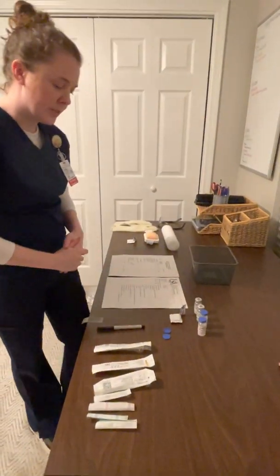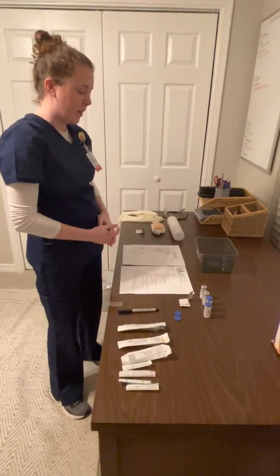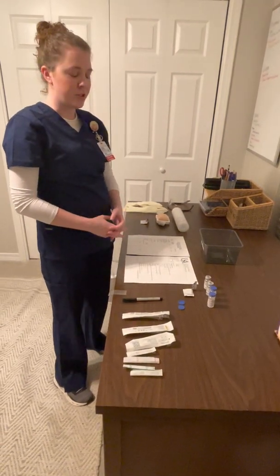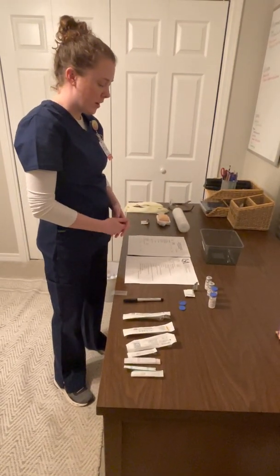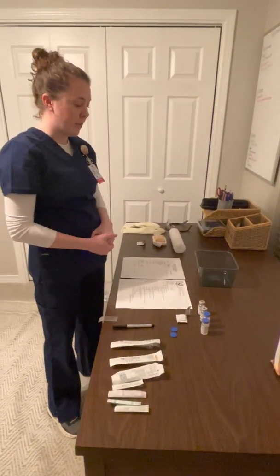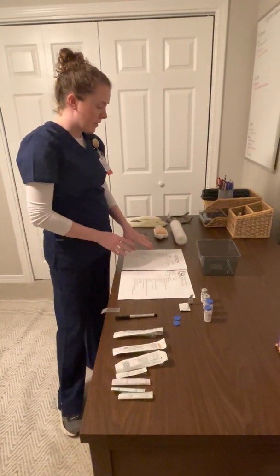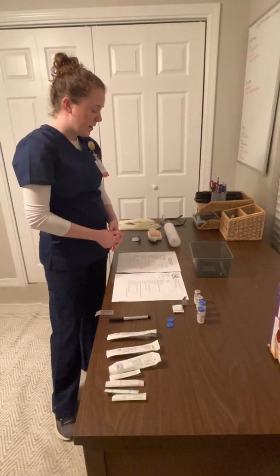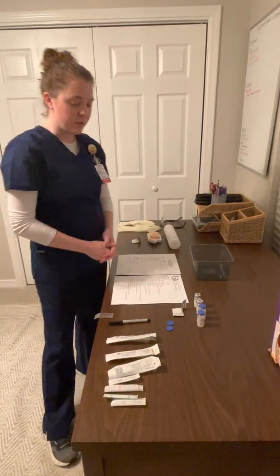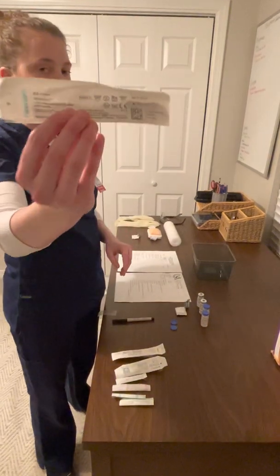The next thing I would do is go ahead and verify the right time. So here on the patient care order form, I see that it's 8 o'clock and that the patient has not been administered any medication. So according to my time, I know that I would now need to give the patient the medication. Next would be the right route. So I see that the patient has been ordered to receive the heparin at 5,000 units subcutaneously. So for a subcutaneous injection, I would use a 1 milliliter tuberculin safety syringe.